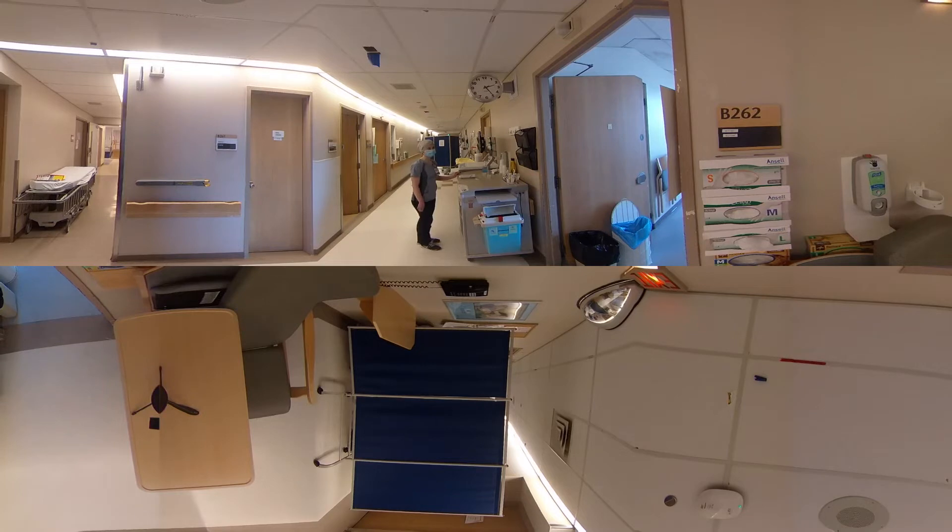I'm getting ready to bring in my medication for my patients in this room. I'll start off with the first patient. I'm going to look up their medication on the MAR on the workstation, just to confirm. I have my medication here. Now that I've verified it, I can move over to the rover and begin to scan the medication for my first patient.